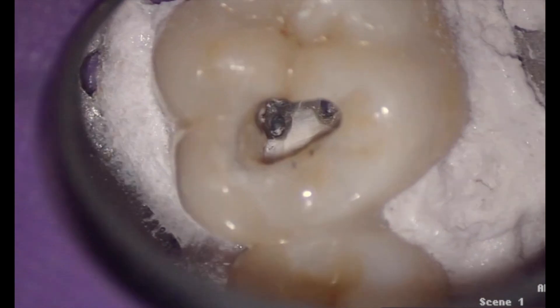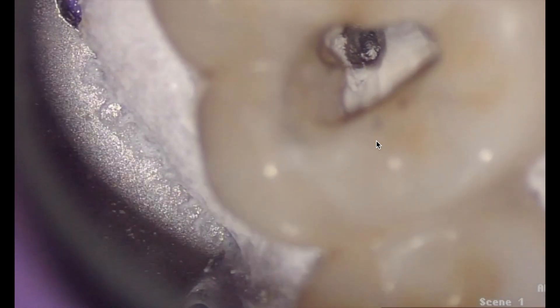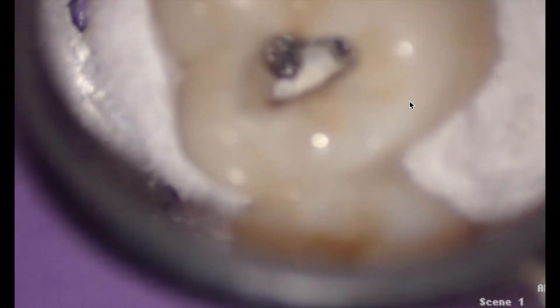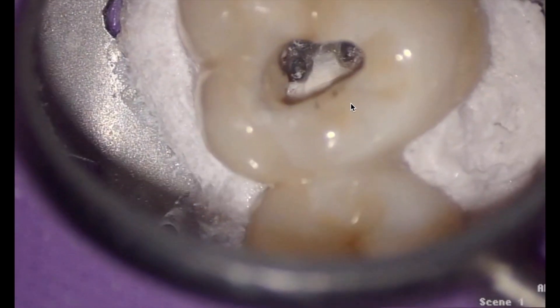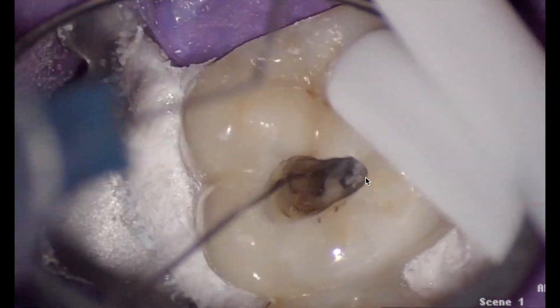I am human. Zoomed back in, you can see there's MB1 and there's MB2. The point is you're really going to want to place your file and start tackling when that little sucker's orifice of death is visible — but it actually comes a lot more mesial. It took me about a half hour to get down this canal. As I progressed, I actually had to move it even more mesially.